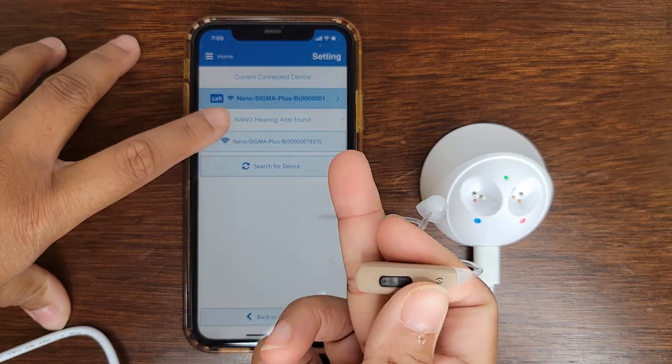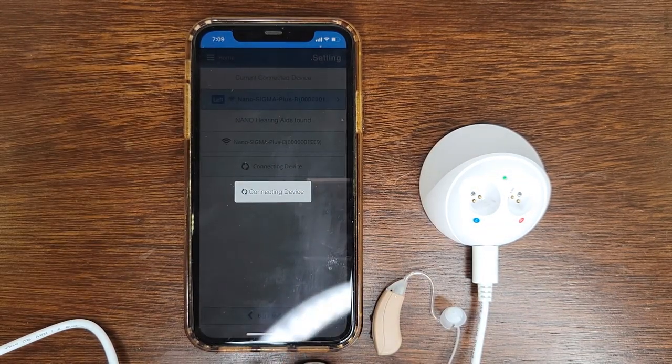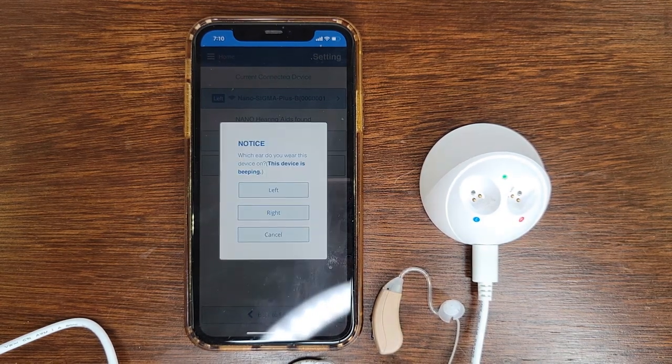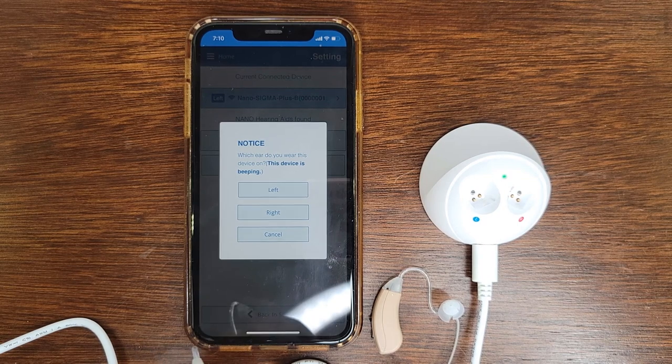So it's still glowing red, it's green, so we're gonna connect it now. It does take a little bit of time to connect, so we gotta wait patiently. And once it's connected, we're gonna do the same process. So this is the notification that popped up.